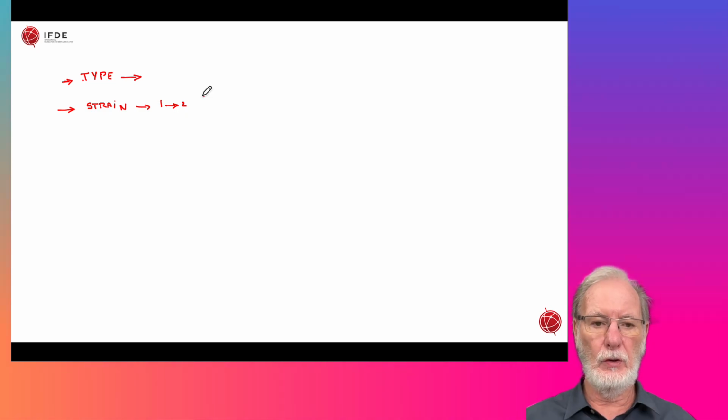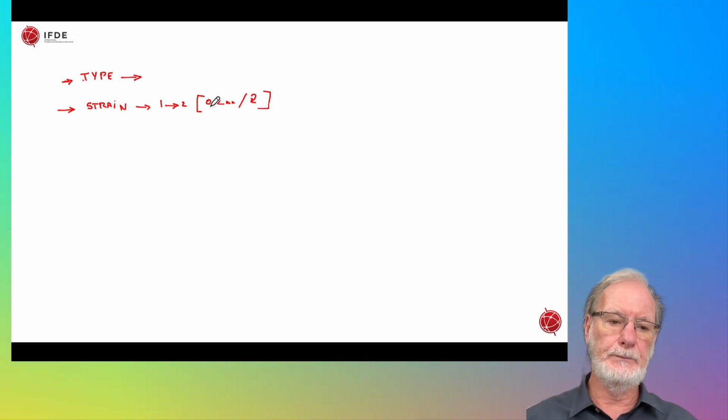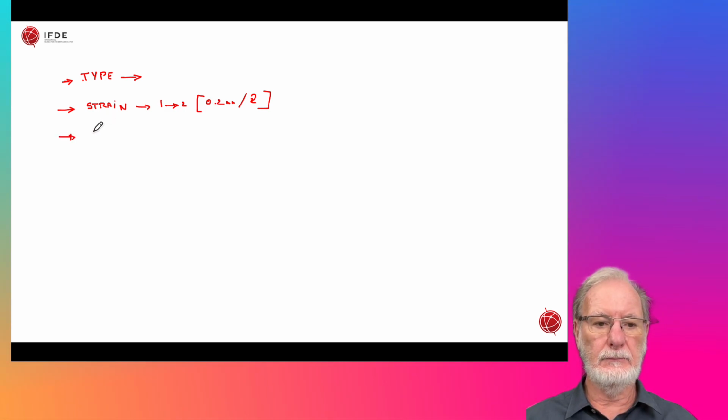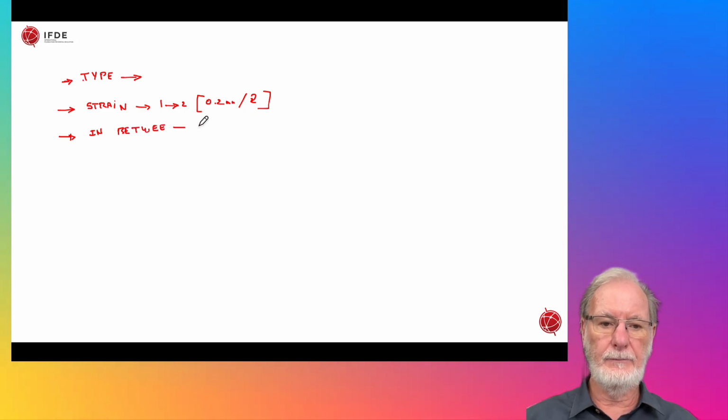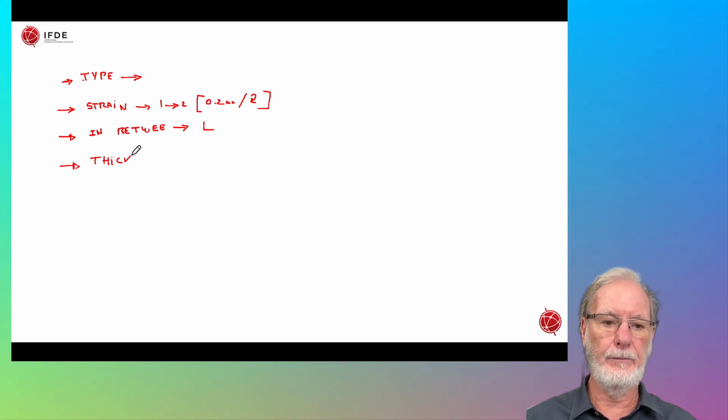How much? We usually always use, like 0.2 millimeters of translation and maybe 2 degrees of rotation. But that's an average. You should be able to, in some cases, decide what you want to do. You also need to calculate your amount of material in between the active part. So this would be the length, and also the thickness of the material plays a super important role.